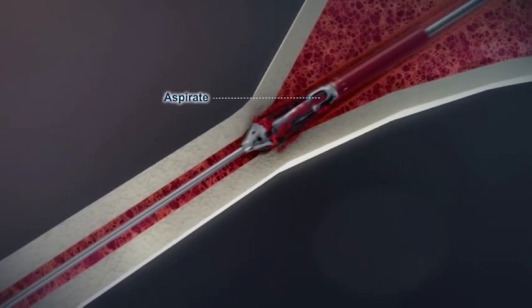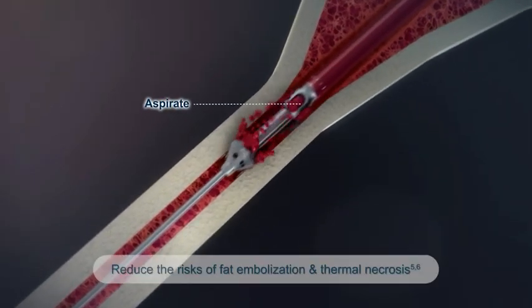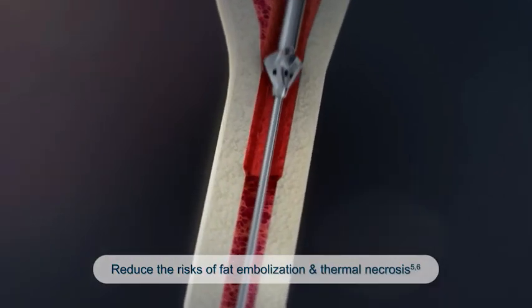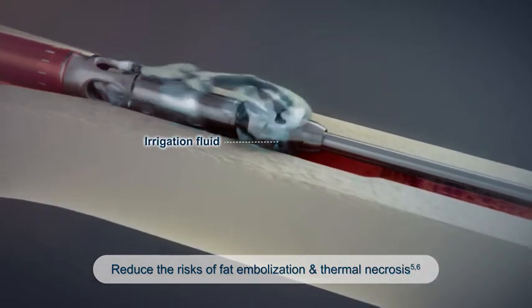The aspiration facilitates removal of morselized bone tissues and reduces the risk of fat embolization, while the irrigation is applied directly to the cutting site, reducing the risk of thermal necrosis.